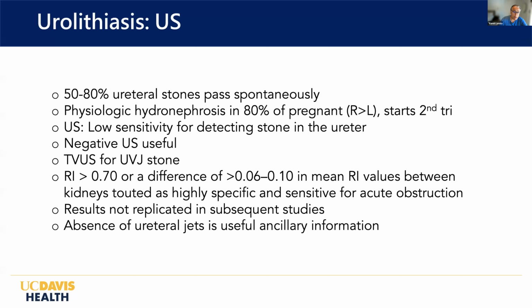Now, one technique I personally find very useful, and I've done a few times, is doing an endovaginal ultrasound to identify a UVJ stone in a patient who has hydronephrosis and the appropriate symptoms. Now, what has been reported in the literature is the role of resistive indices.